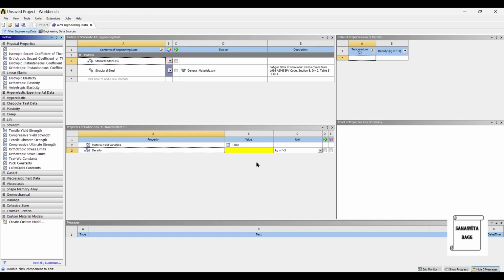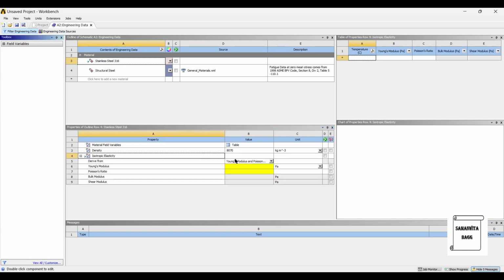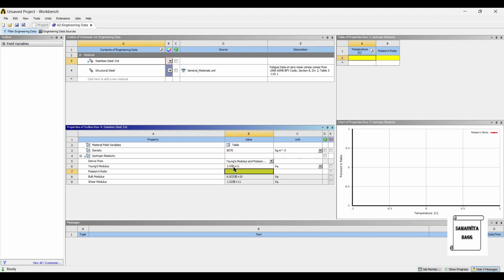First, we'll give the density as a property. The value of density is 8.07 gram per centimeter cube. So I have converted it to kg per meter cube. Next, I'm going to give the isotropic elasticity. The value of Young's modulus is 205 gigapascal. So it is 205 E9 pascals. Poisson's ratio value is 0.275.